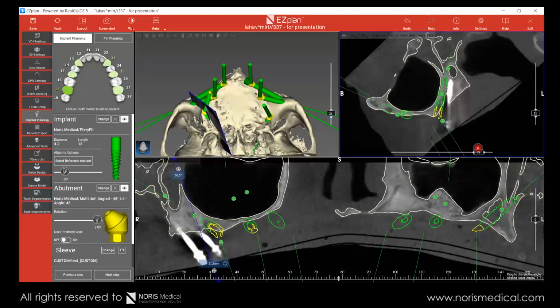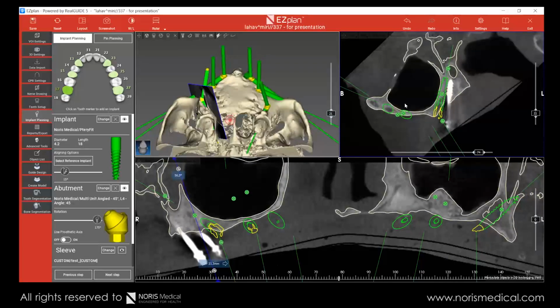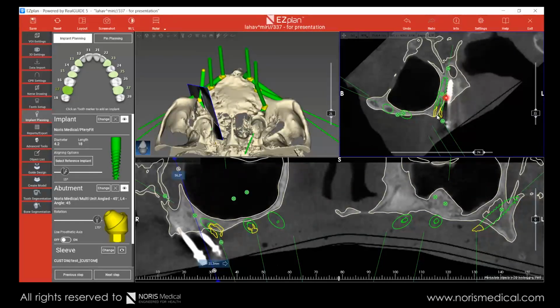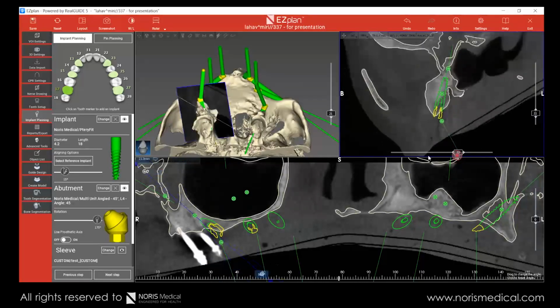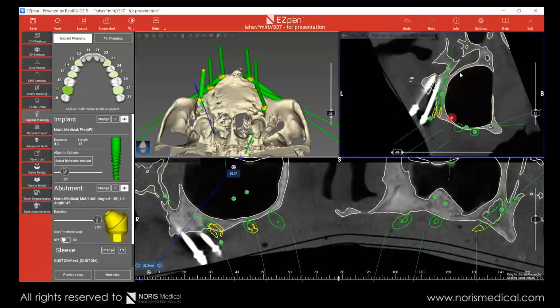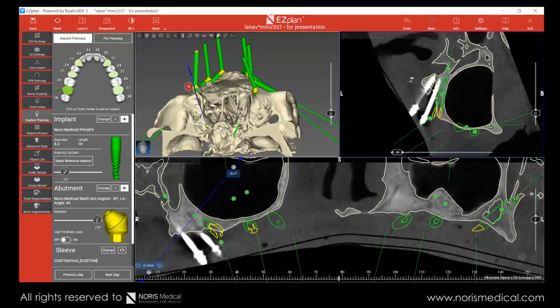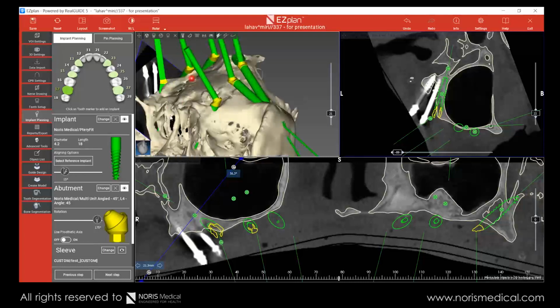See, in this case, there was already an implant here that failed. And that's why this implant was put mesial to this implant. The current implant was removed and another pterygoid was placed towards, it had to be more mesial, so it's not exactly the positioning of a pterygoid, but it's still working. It's going towards the fossa here, towards the medial plate here, and it's going to hold. You see, it's going to hold here.